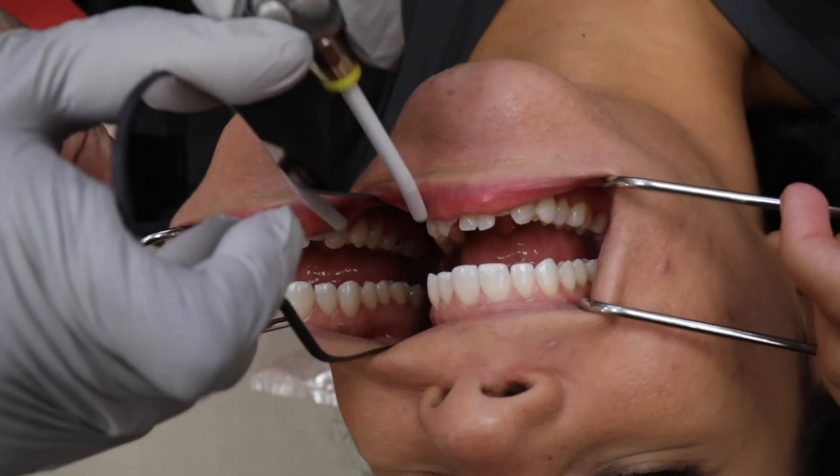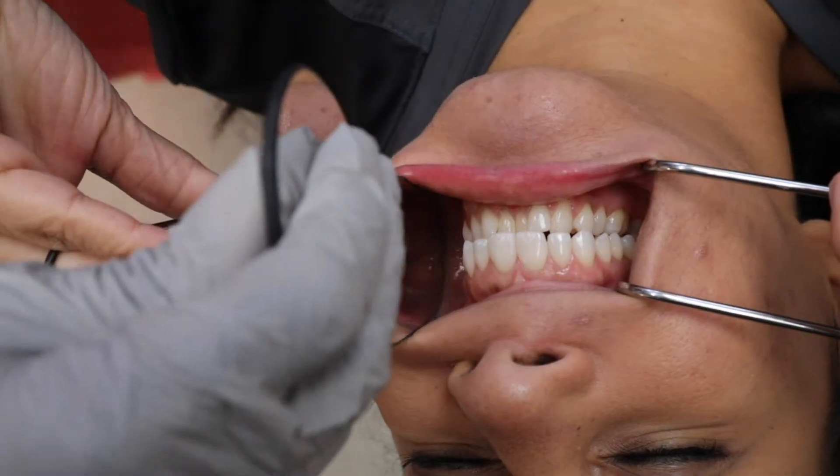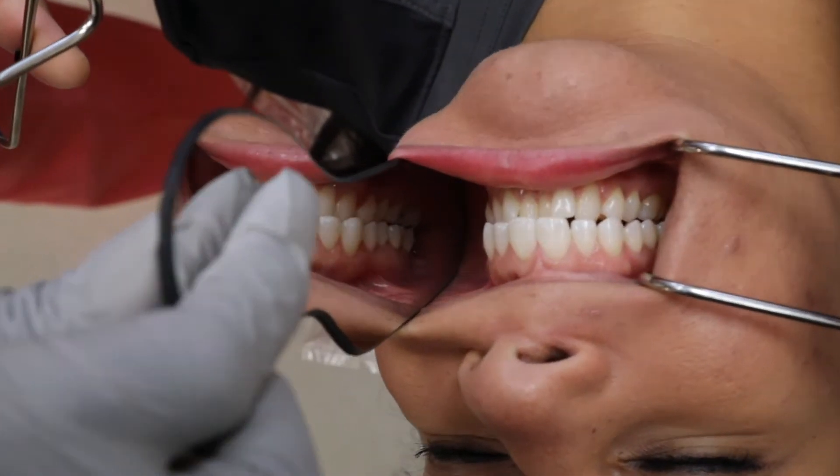The assistant helps with the mirrors and controls moisture while I concentrate on framing the shot and capturing a good image.